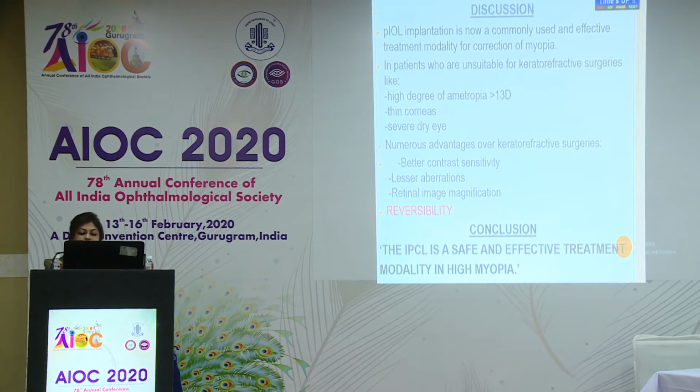So I conclude that the IPCL is a safe and effective treatment modality for patients with high myopia. Thank you.